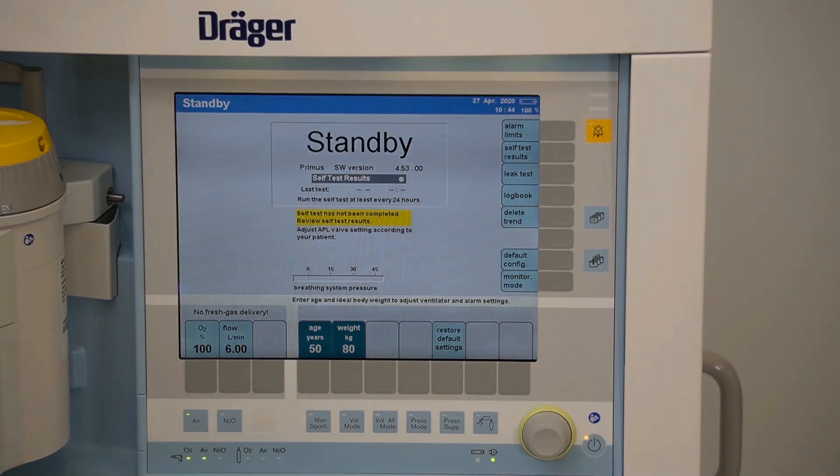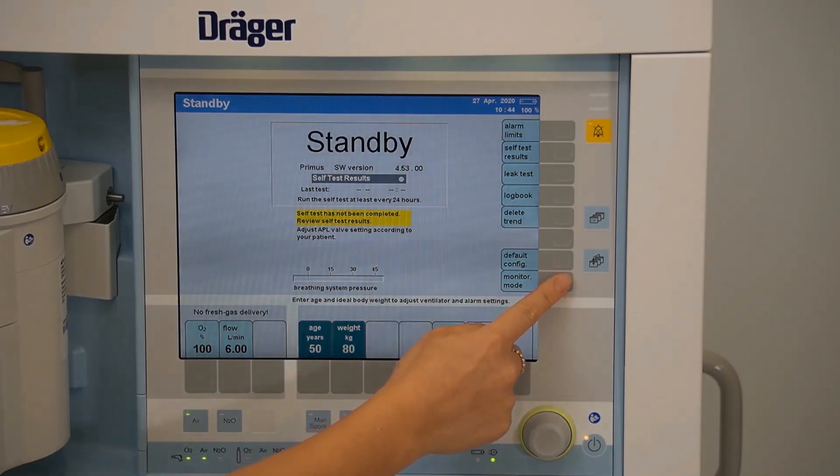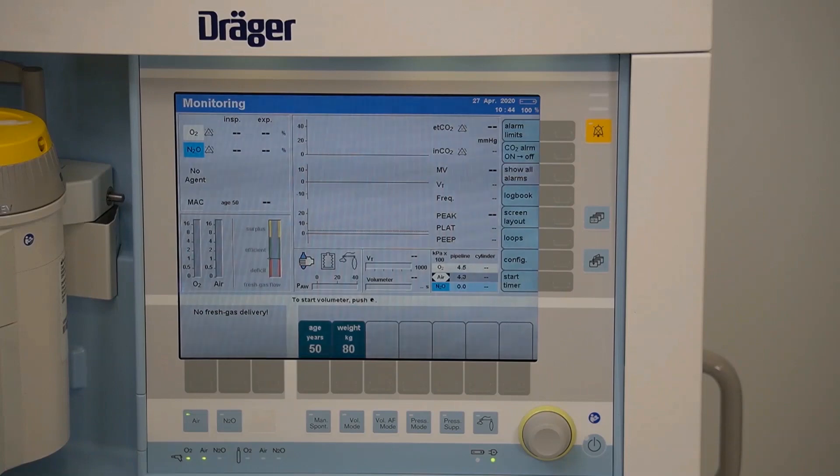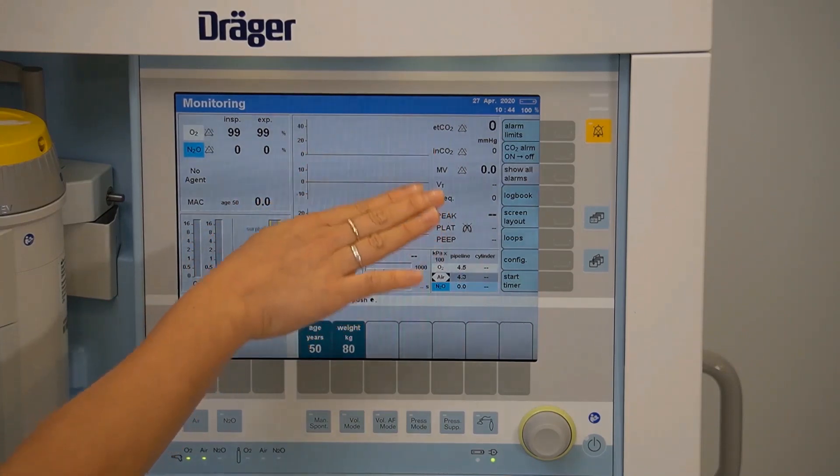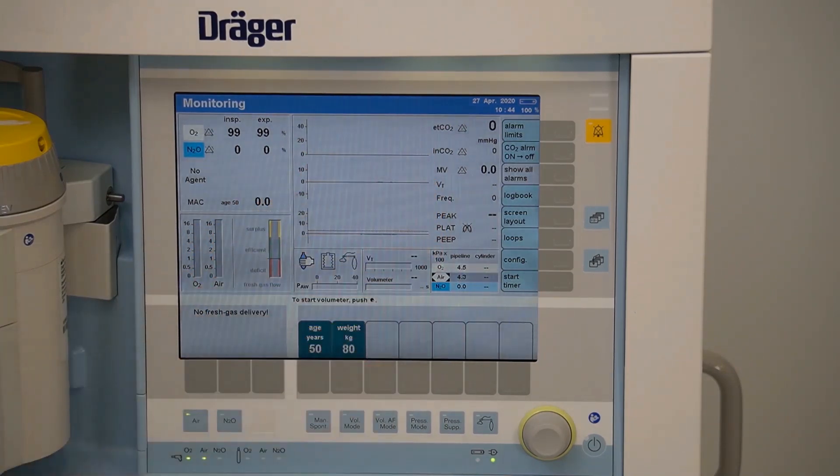To access monitor mode, this can be selected from the main screen. This mode will give you no fresh gas delivery, will monitor your CO2, and all other alarms will be paused.